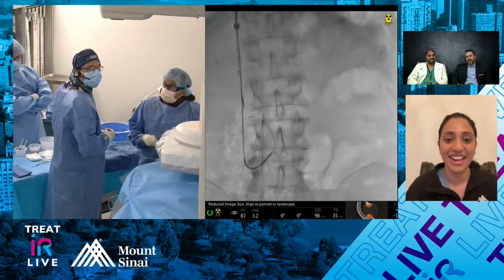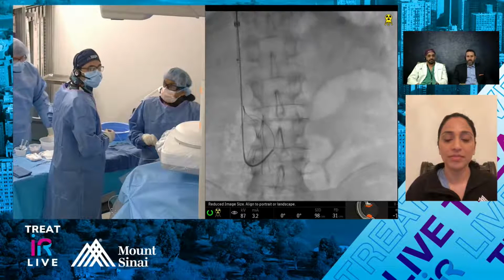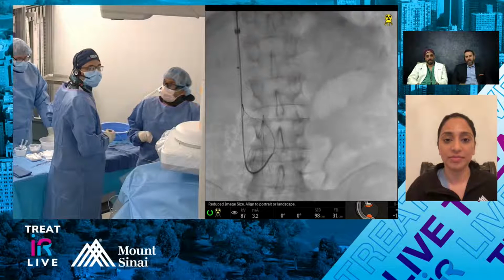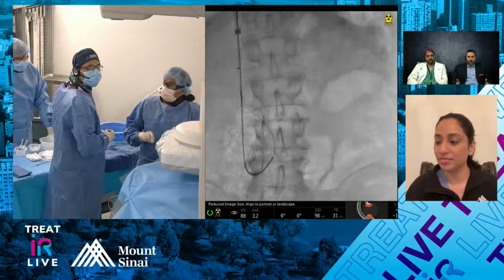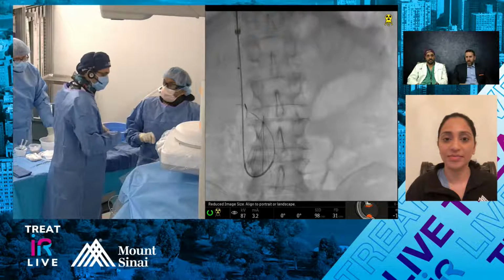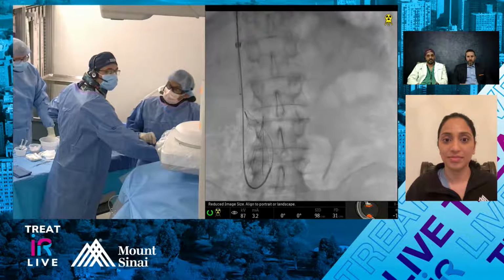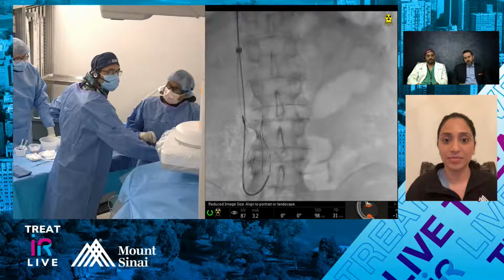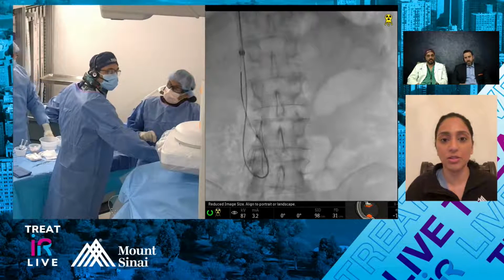I think one of the big benefits of the laser isn't necessarily to get things out that we wouldn't otherwise. I think it allows you to do it with a little bit less force. But with experience, you get a feel for what feels right and what doesn't, like we were saying about feedback from the patient, and you can change what you're doing if it doesn't feel right. Mona, how's your experience with the laser been? What's good? What's difficult? I haven't had much success there either.